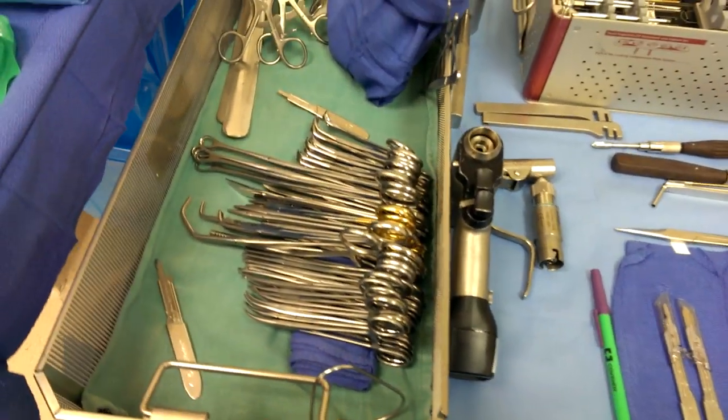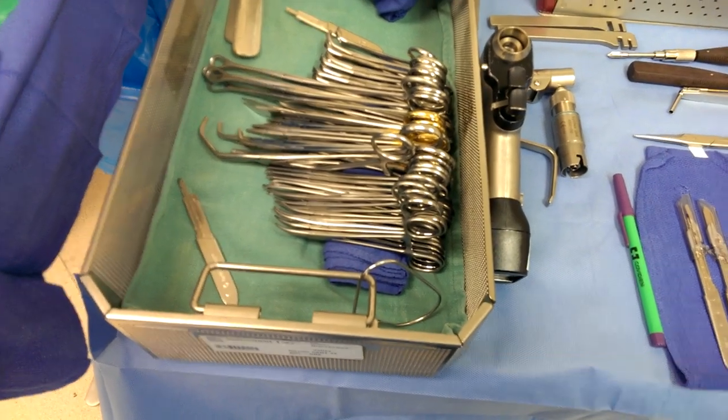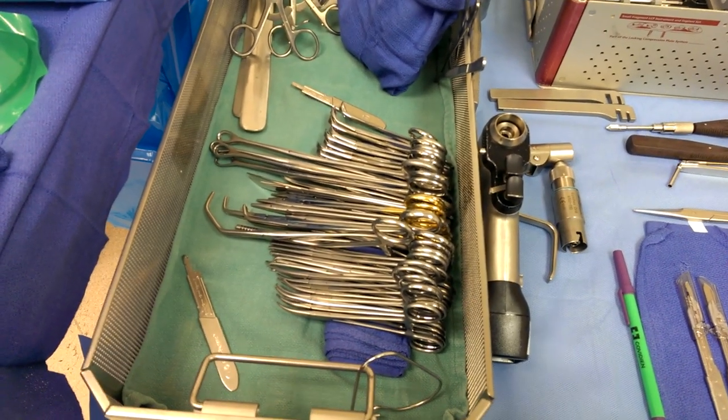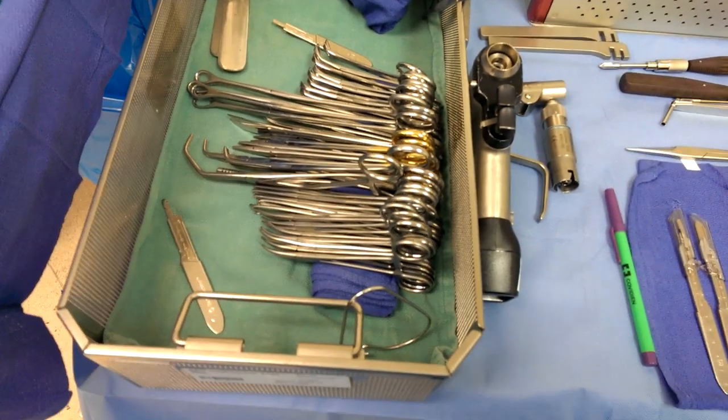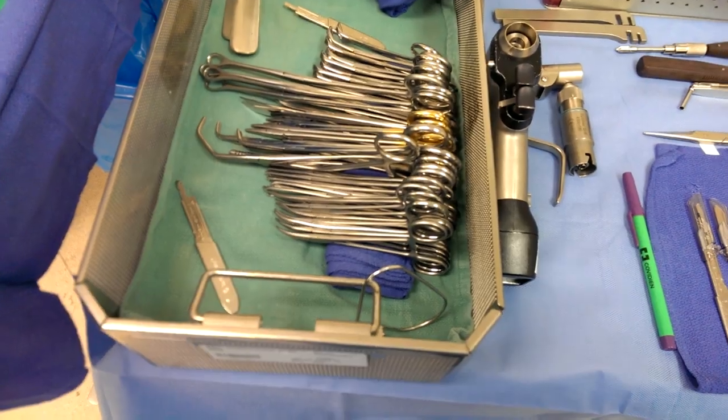As you can see, the basic ortho tray. I keep the instruments neat because I don't want to fumble for things that are not anticipated. If they need something else, I can just reach in there and it's neatly put together so I can reach and get it real easy.